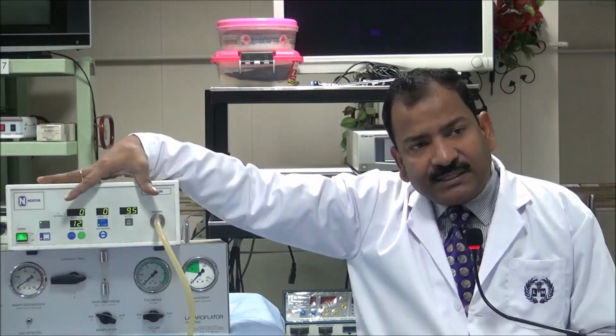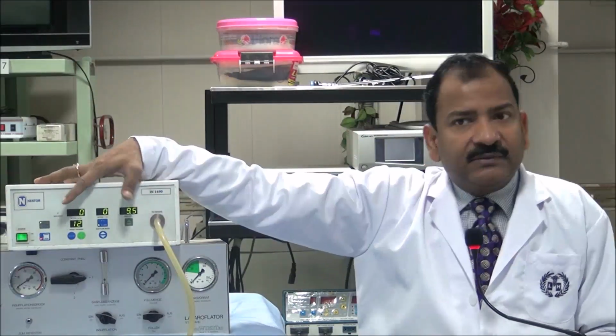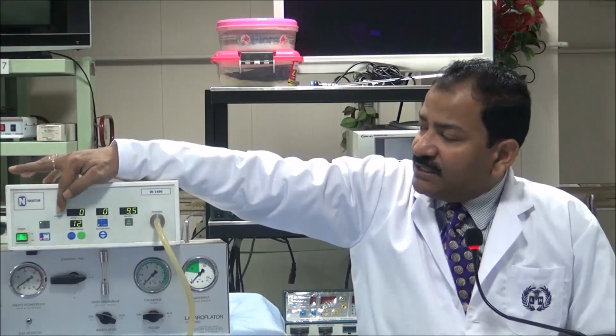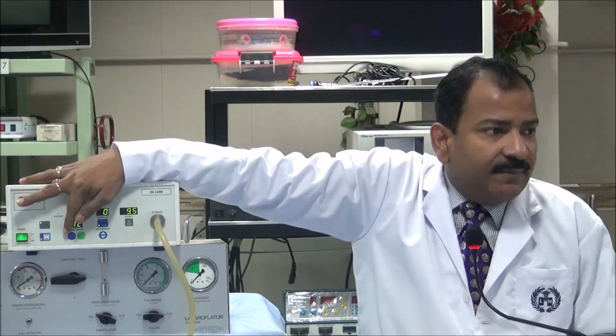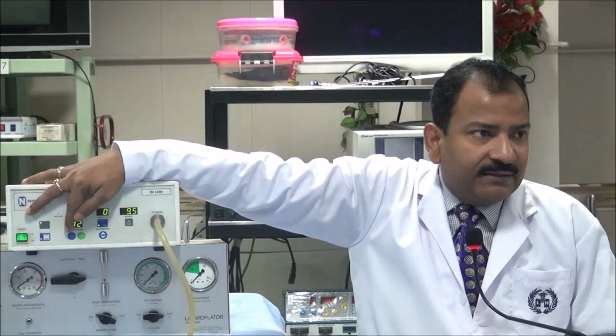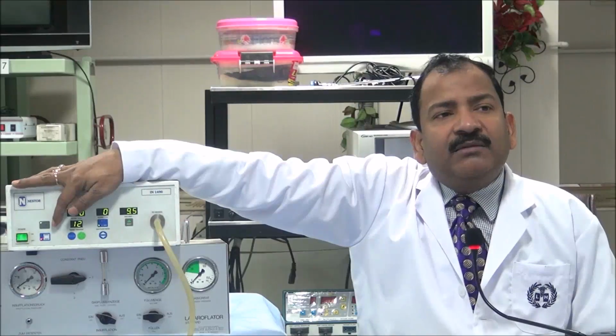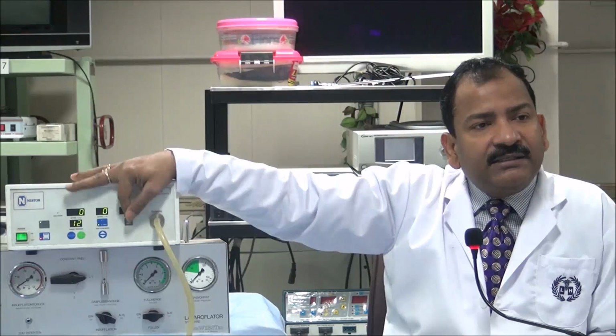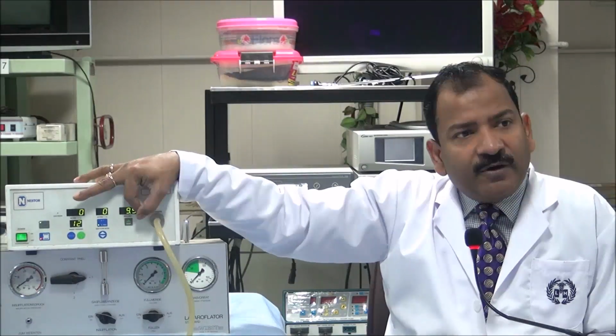Before putting the first trocar, our actual pressure should reach the preset pressure, isn't it? And at 12 millimeter preset pressure, the amount of gas required is minimum 1.5 and maximum 6 liters.